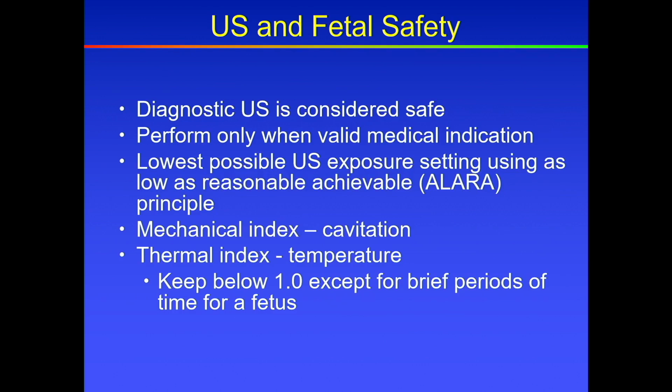So just an overview, ultrasound and fetal safety. Diagnostic ultrasound is considered safe during pregnancy. Performed, though, only for medical indications. So the society guidelines say don't go to the mall, to that ultrasound suite, just to get pretty pictures, though even at our institution we do give the moms pretty pictures, of course, and we even have a cloud-based system where they get sent directly to them now instead of just the thermal printout.